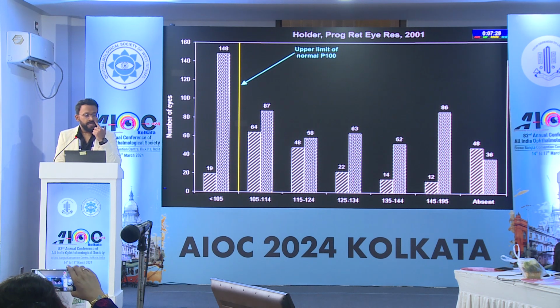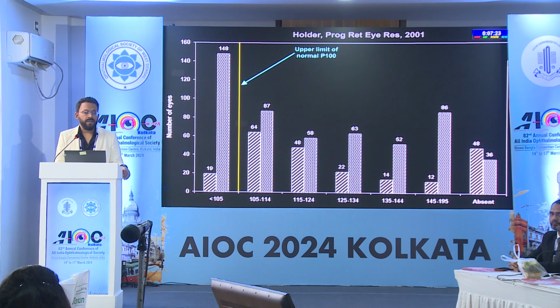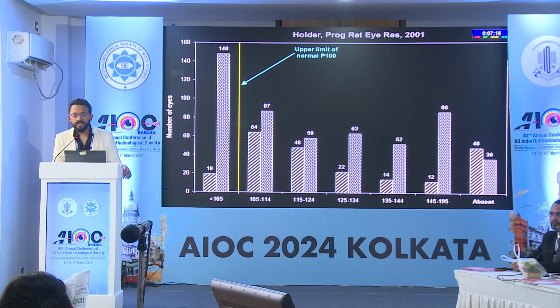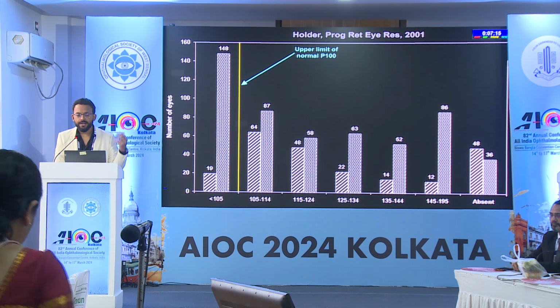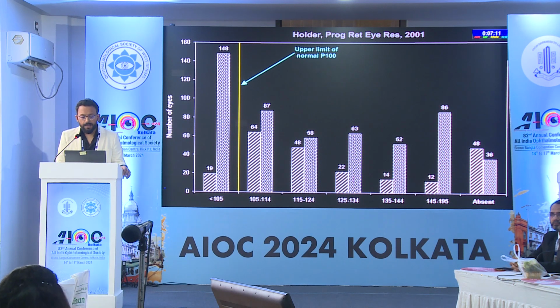So what happens when there is a poorly functioning retina, a poor visual acuity, and we are not able to find anything on the posterior pole? We usually tend to order a VER. That is the first go-to electrophysiology, the most common electrophysiology that is performed. But if there is a disorder at the macula or the optic nerve, a VER will give equally reduced results. So if you have to take home anything from my presentation, it is the two graphs that I'll be showing you right away.